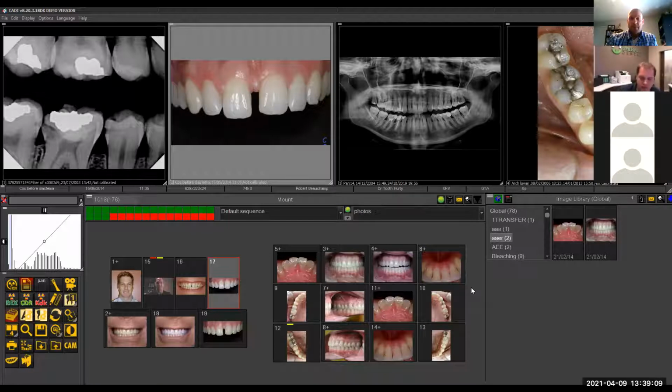You said you usually designate one computer is the way you do it. Is there a way to set it up like, if every operatory had a card reader, on one station you click that button, and on that computer it would know to go to that card reader? If you went to a different station, it would know to go to a different card reader, because it would be on that same station. Yeah. The way that the software works is it's programmed per station, and you can tweak it per station, and you can have different layouts per station. So it's very, very versatile.